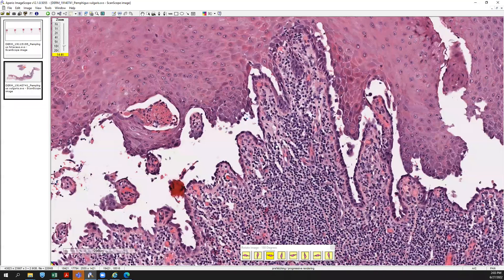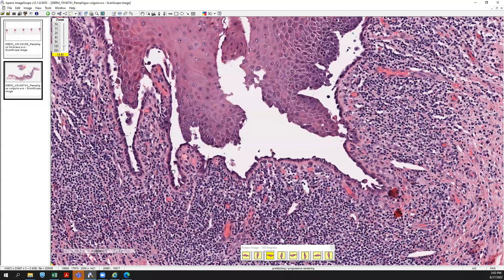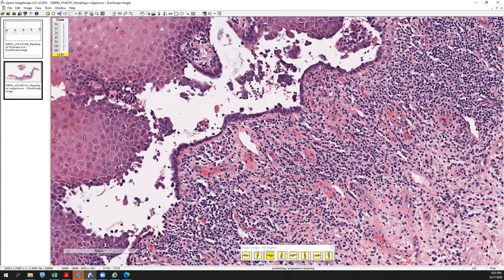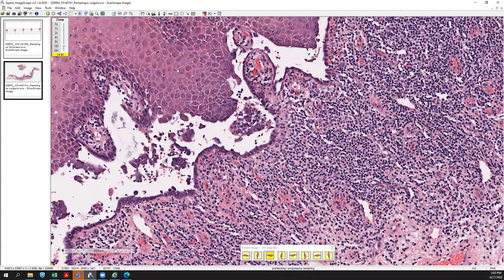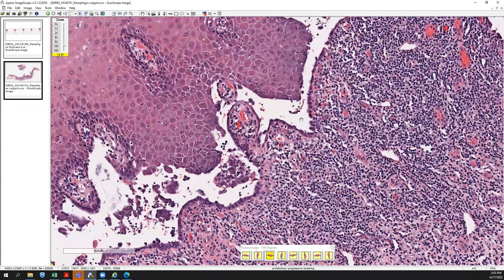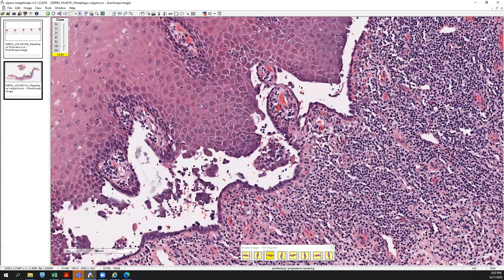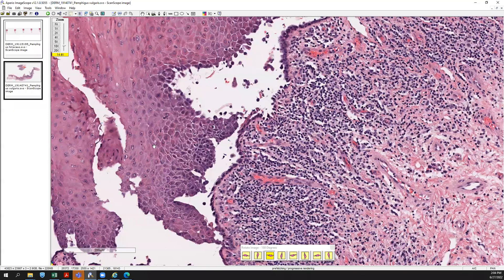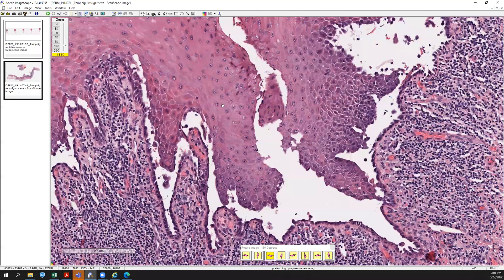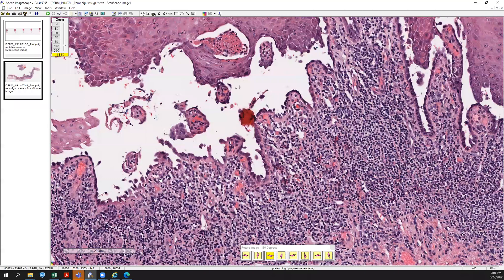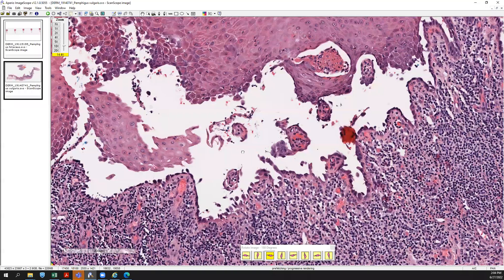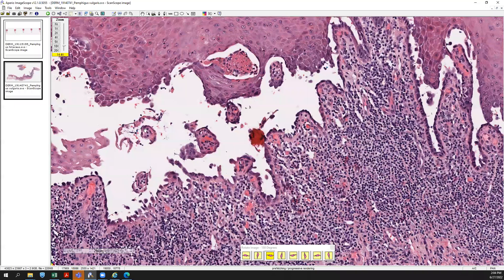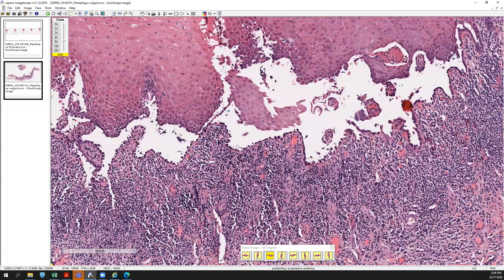I typically think of pemphigus vulgaris as being more likely to involve adnexal structures compared to Hailey-Hailey, where you might get very similar histologic pictures of acantholysis without much dyskeratosis. Clinically, Hailey-Hailey is going to present with even more flaccid vesicles forming wet plaques, many times in the intertriginous areas — so it presents differently than pemphigus vulgaris. It is not an autoantibody-mediated process; it's a defect in ATP2C1, which is a calcium pump, and that leads to the acantholysis. Very different pathophysiologies but very similar histopathologic appearances.